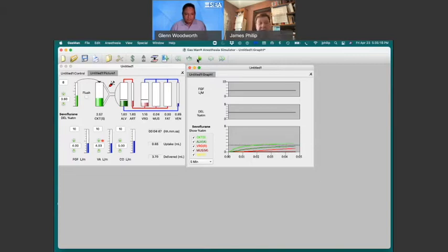Now I've paused things when the vaporizer was set to 3.6%. That, by the way, is the magic number for sevoflurane. That's the inspired concentration that will get the expired concentration up to 1 MAC based upon the blood gas solubility of sevoflurane. But we don't learn that until the next chapter in the book. But that's why it was set there, to make it easy to get the anesthetic to the right level.